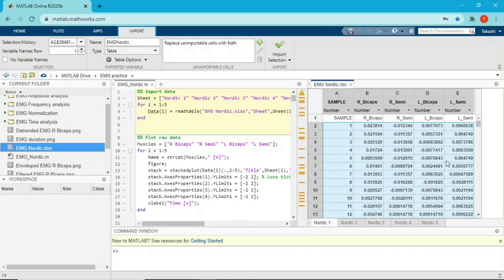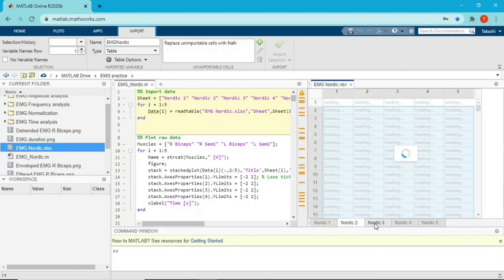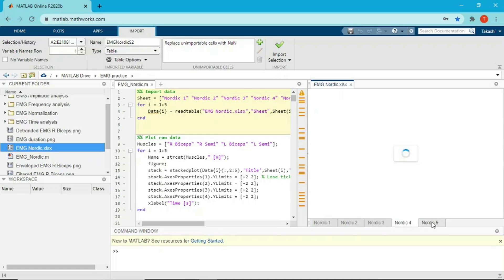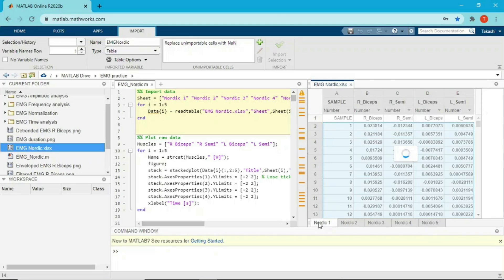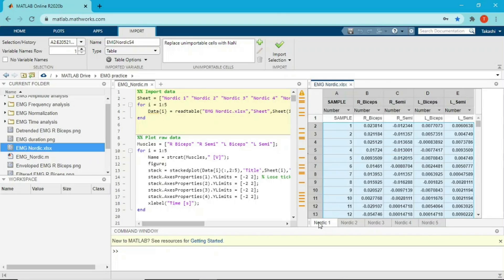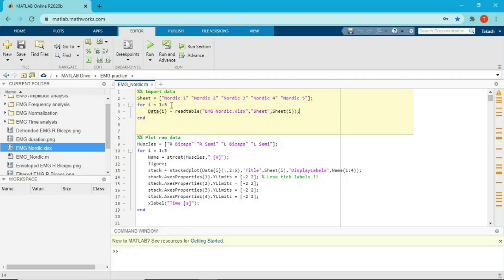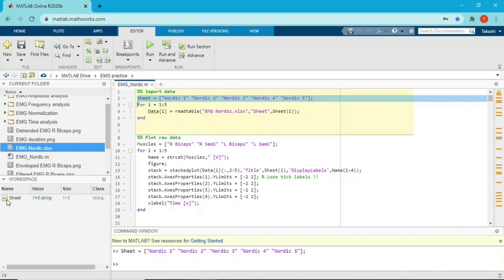I already imported the data into MATLAB. Let's see what the data looks like. This is the raw data — the format is an Excel file. As you're probably familiar with the format, there are five sheets: first sheet, second sheet, third sheet, fourth sheet, fifth sheet. I already explained the experiment — I put the EMG on my hamstring, biceps femoris, semi-tendinosus, right and left side, and did Nordic hamstring curl five times. Five times, five sheets — that's reasonable.